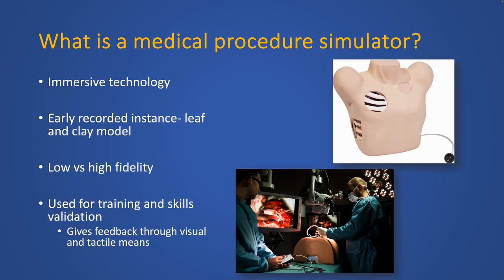First, what is a medical procedure simulator? It is an immersive technology used to train clinicians on critical clinical skills. This can be done in a variety of ways to include task trainers, mannequins, robotic simulators, interactive software programs, and virtual reality or augmented reality.